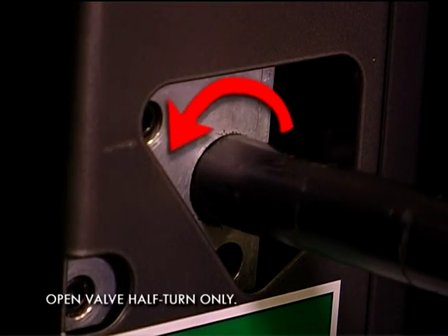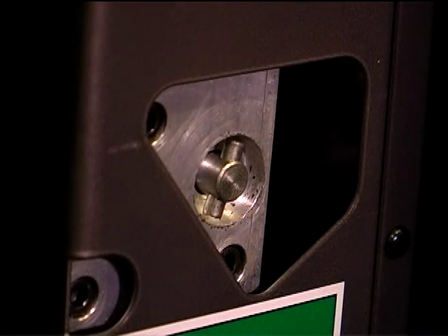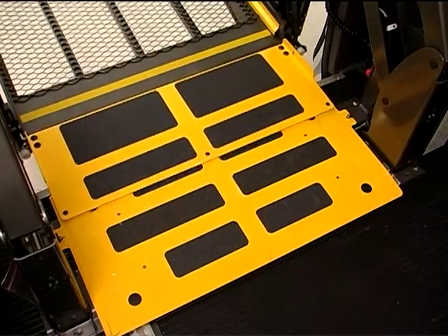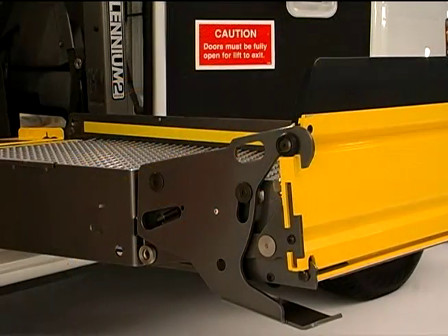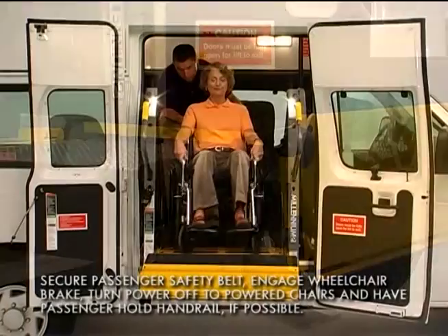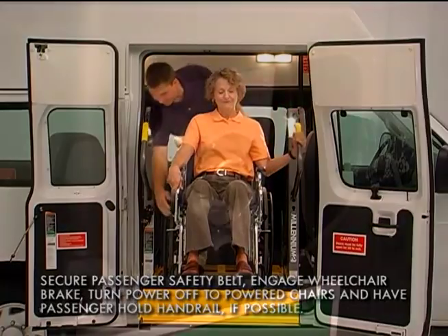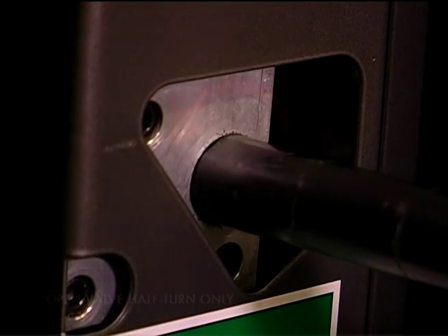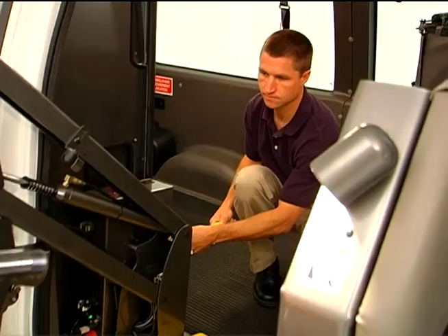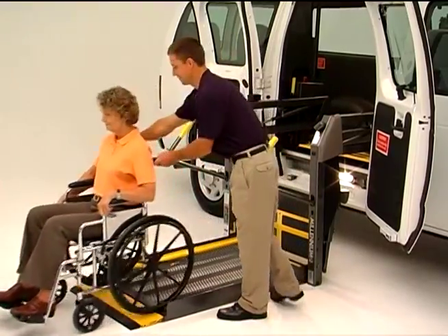Then open the hand pump valve by turning it counter-clockwise, which will allow the platform to slowly unfold. Close the hand pump valve clockwise when the platform reaches floor level. Check to be sure that the inner barrier is in its fully horizontal position and that the outer barrier is in its fully vertical position and the outer barrier latch is engaged. Then load your passenger onto the platform as you would during normal automatic operation. Open the release valve again by turning it counter-clockwise one half turn only to allow the platform to slowly move to ground level and the outer barrier to unfold fully. Then move your passenger off of the platform and away from the vehicle.